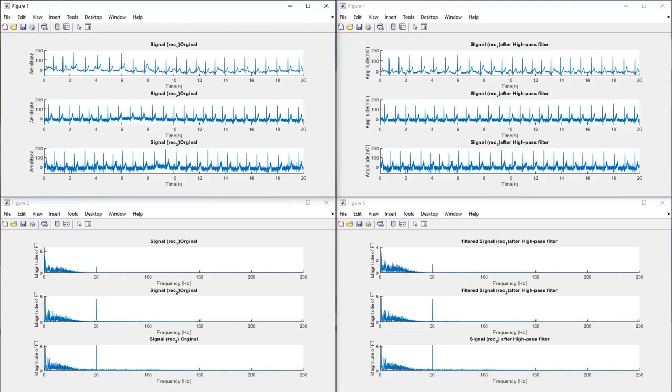Before filtering this data, some key characteristics had to be known about the signal so they don't get accidentally filtered out. There are a lot of different filters, and FIR and IIR are the main two classifications that can be used, and these filters are mostly used in different circumstances. IIR are mostly used for offline data, meaning we have all the data downloaded on our computer, and from all of these different IIR filters we chose to work with the Chebyshev Type 2.